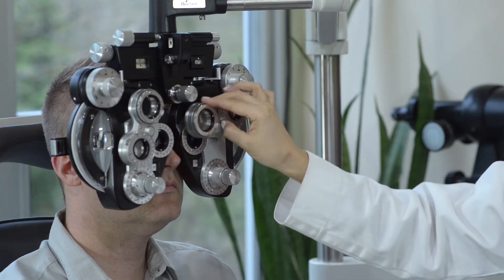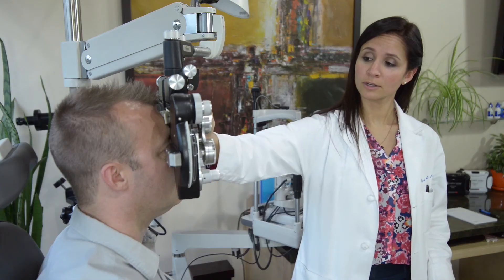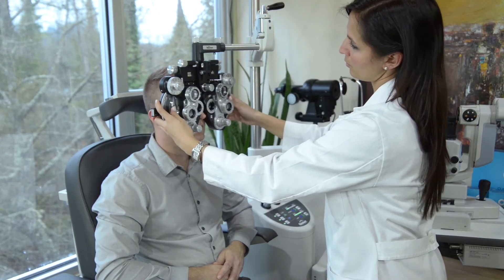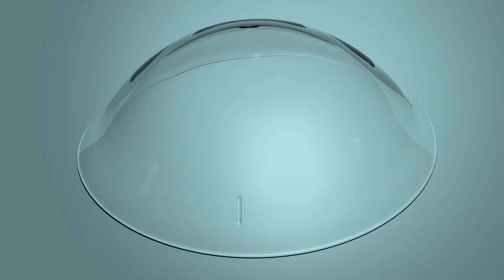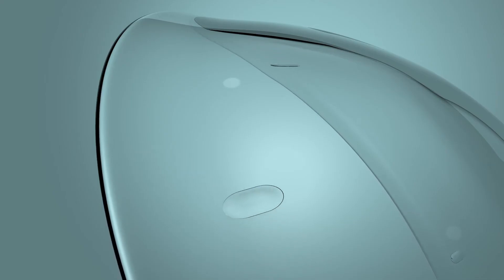Attempt to get the patient to a successful line of vision without the use of refractive cylinder. The tear lens of the Custom Stable lenses is designed to perfect the cornea, often achieving great vision with a symmetrical, rotation-free visual field. However, the Custom Stable line is all available with a front toric dual slab-off option for heightened visual acuity if necessary. When a spherical refraction does not yield the best visual acuity, the Custom Stable Elite can be made into a front surface toric — using only the toric back surface for cylinder orientation, without the use of weighting, promoting a thinner lens and optimal corneal health.